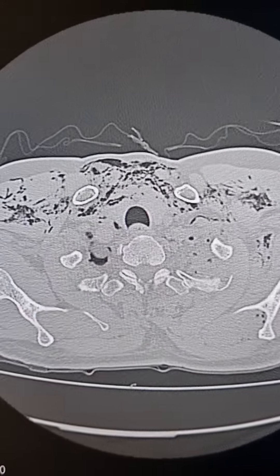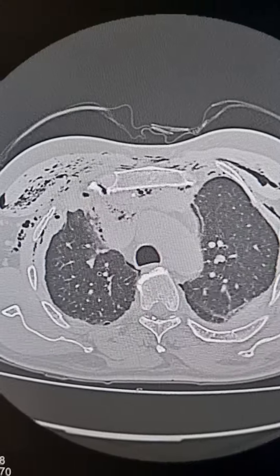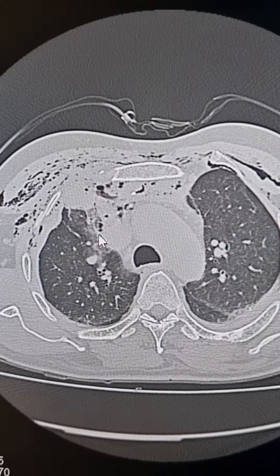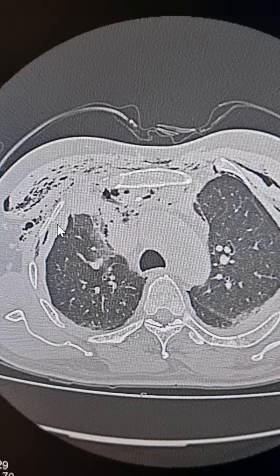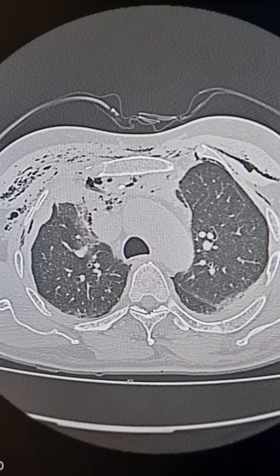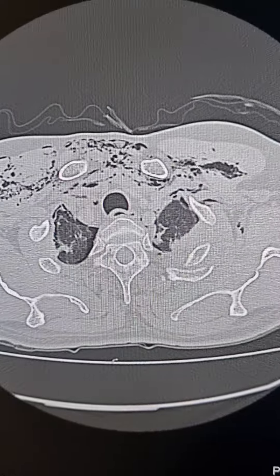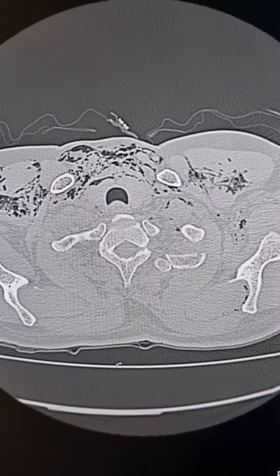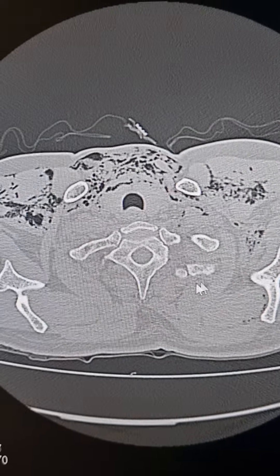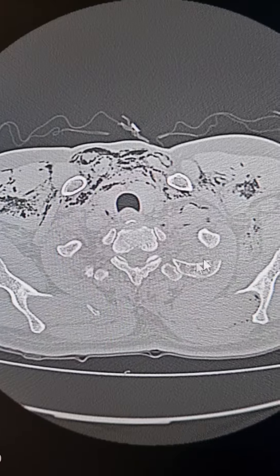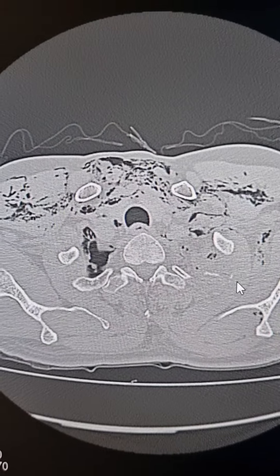On the right side, there is a fracture of the anterior part of the right second rib here. On the left side, the posterior ends of the left first rib and this second rib are fractured.